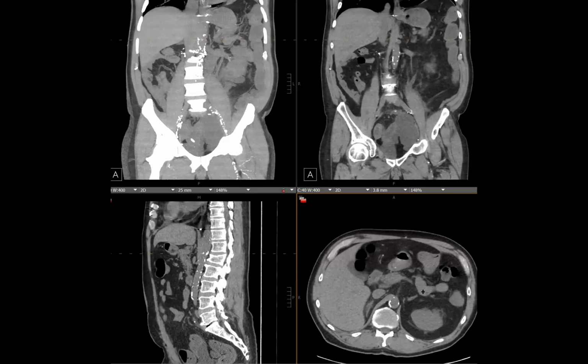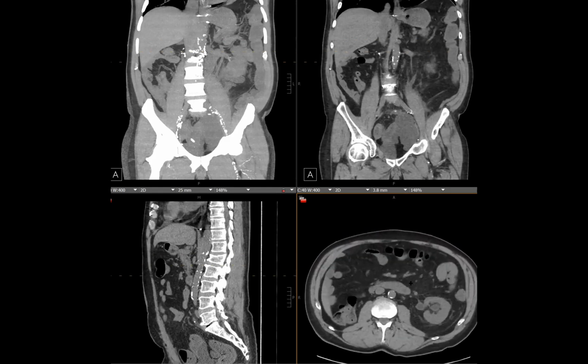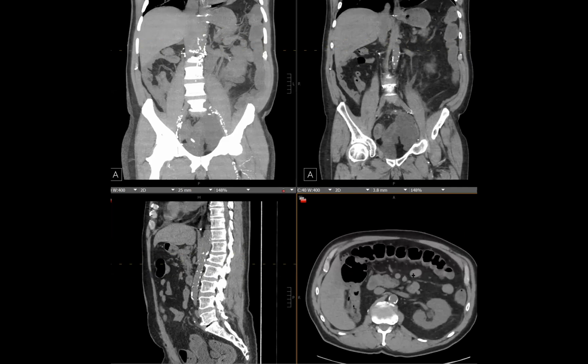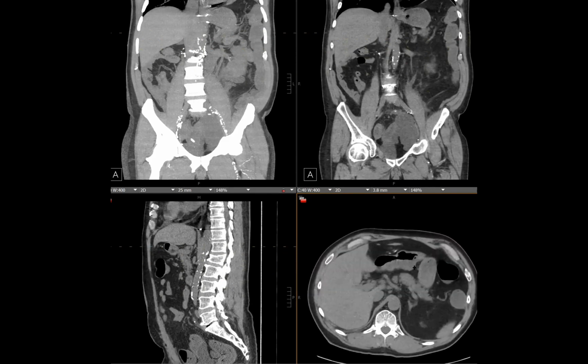So, okay, great. This other case was here. So this patient has history of bladder cancer, has cystectomy with conduit, and we've been kind of just following him with non-con in the past because of his CKD and solitary kidney. So this was one of the follow-ups, and I think it was a super subtle finding that became less apparent over time. So that was the first one, and then we had a follow-up.